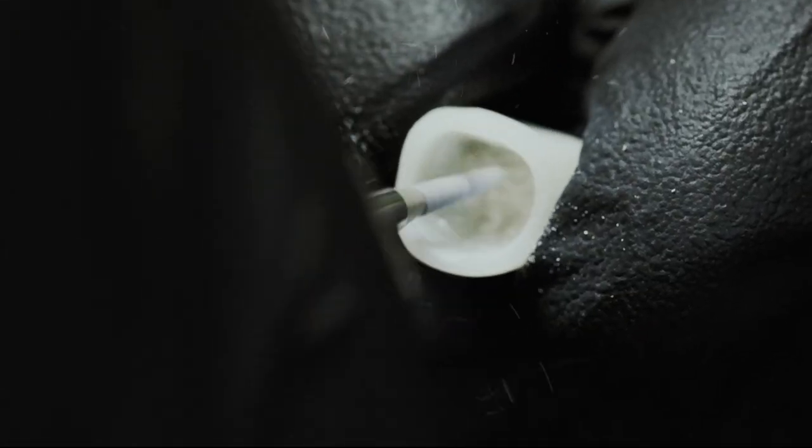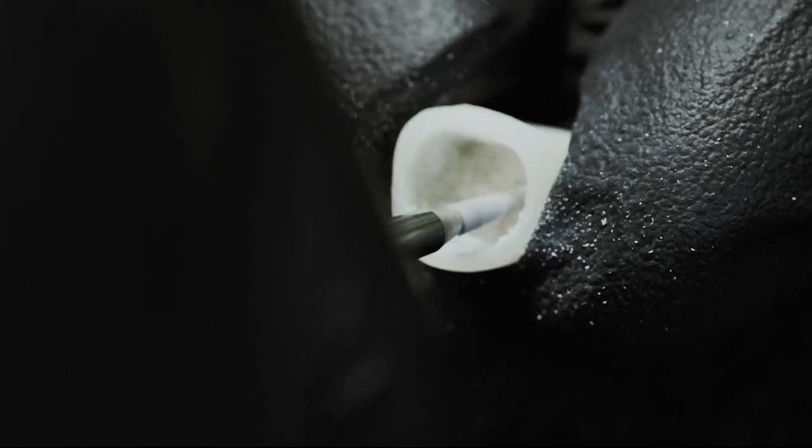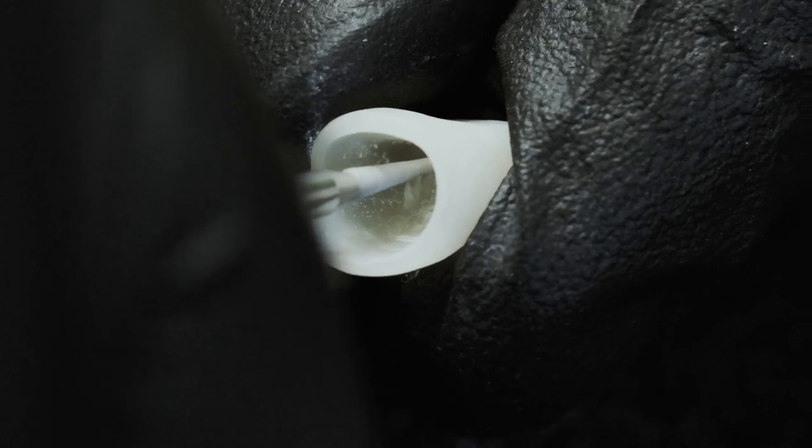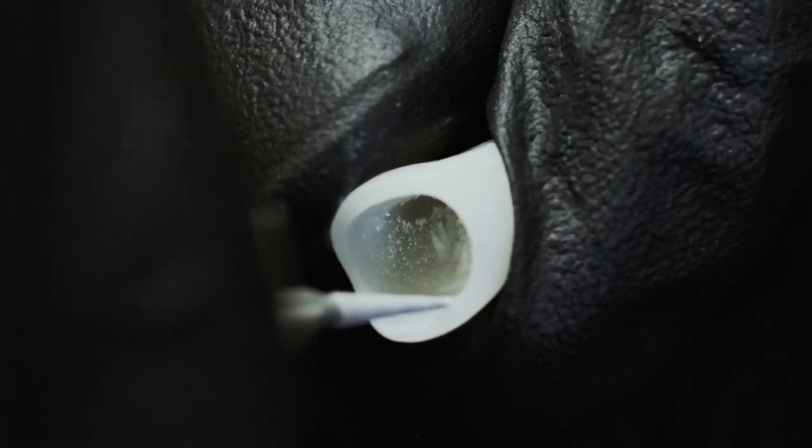To gain more space, the cement gap may be increased during the construction process. However, with the technique that I will now demonstrate, there is no need to increase the cement gap with the machine settings.